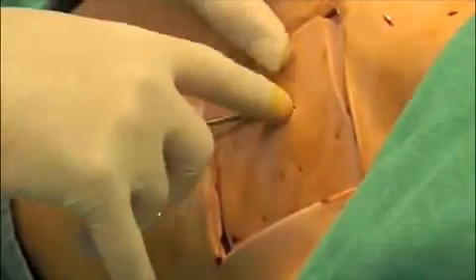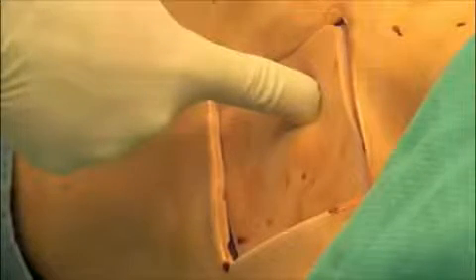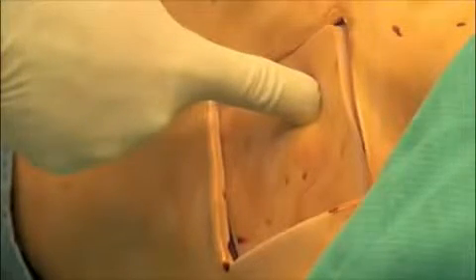While still within the pleural cavity, spread the forceps widely, then remove. Place gloved finger into the incision to verify that the pleura has been entered and to clear any adhesions, clots, etc. The finger should sweep completely around the incision.